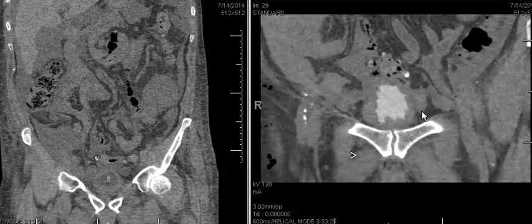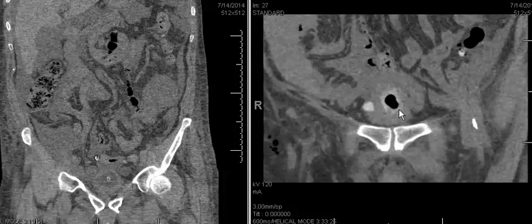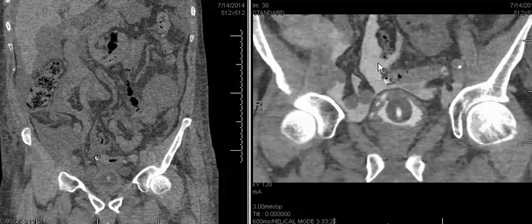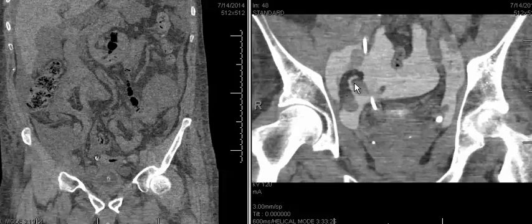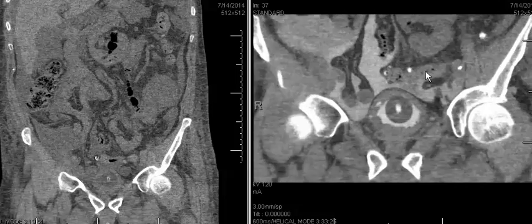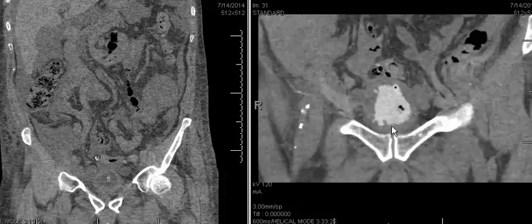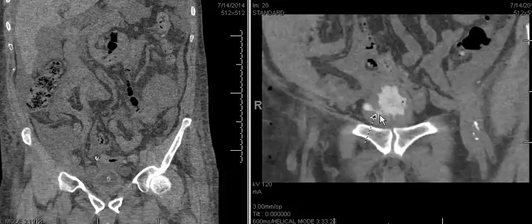Looking at the imaging on the right side of the screen after injection of contrast into the bladder, notice that we see contrast extravasation into the peritoneal spaces surrounding loops of bowel within the right pelvis and abdomen and along the pericolic gutters as well. Notice also that along the right lateral margin of the bladder there is a focal area or defect of contrast extending from the bladder intraluminally through the wall and then into the peritoneum.